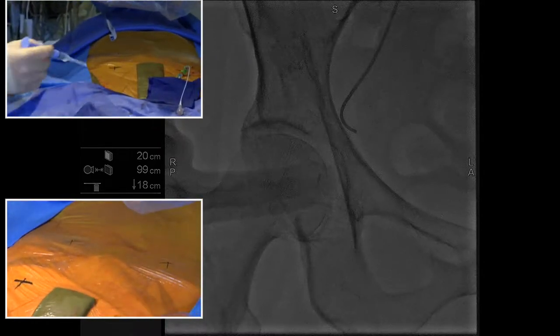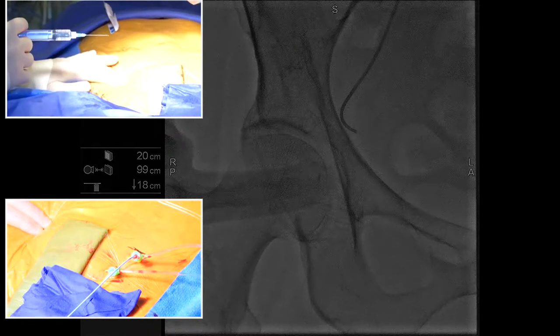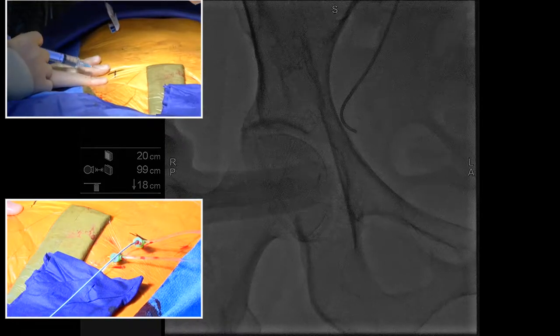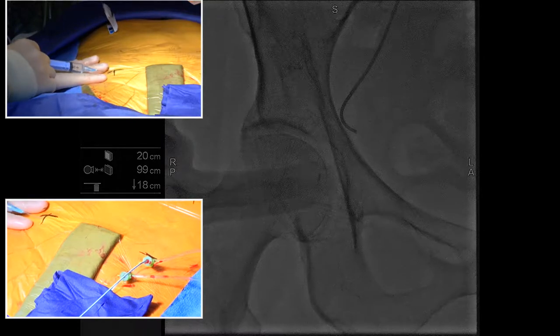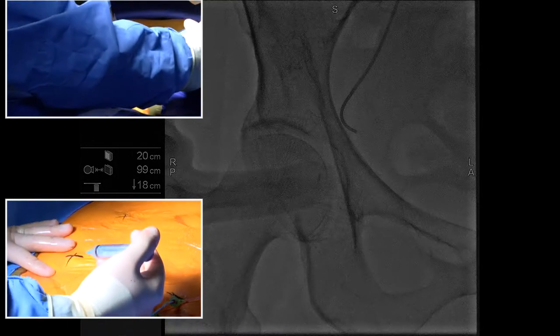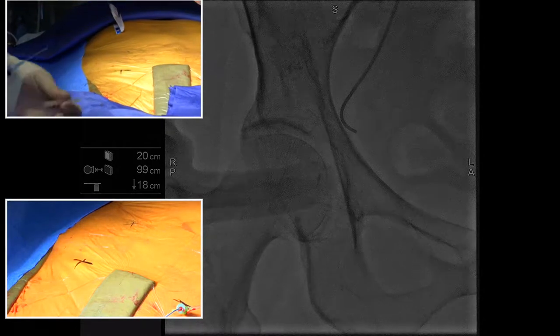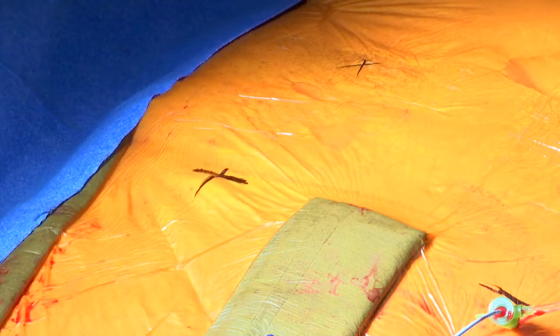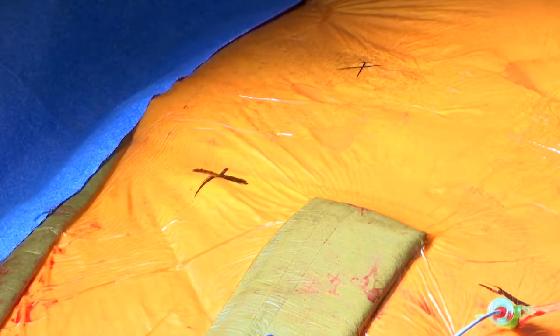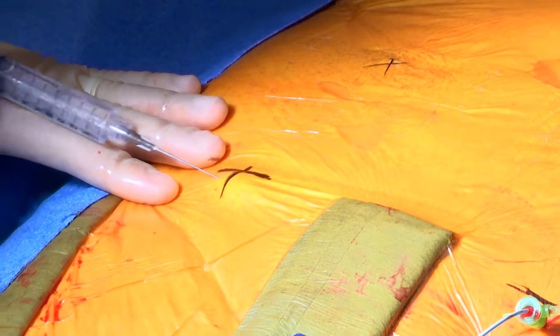So I'm going to give some local anesthetic. This is lidocaine, very similar to what your dentist uses when you get your teeth worked on. So I'm going to numb this area so that the patient is more comfortable. And because we're putting a larger sheath in here, we're going to make a little skin incision, and we're going to actually kind of stretch the skin tract a little bit to make sure that we can get our device in without difficulty. Okay.